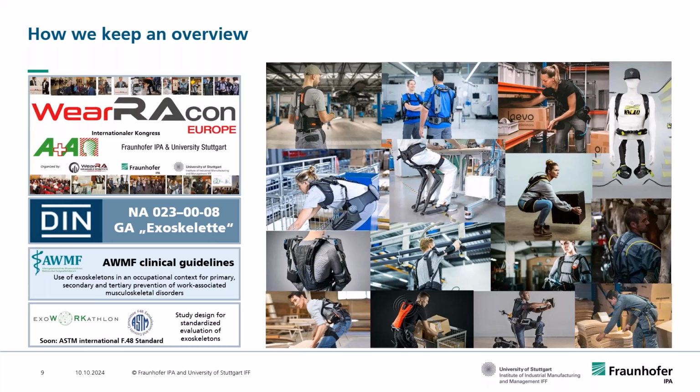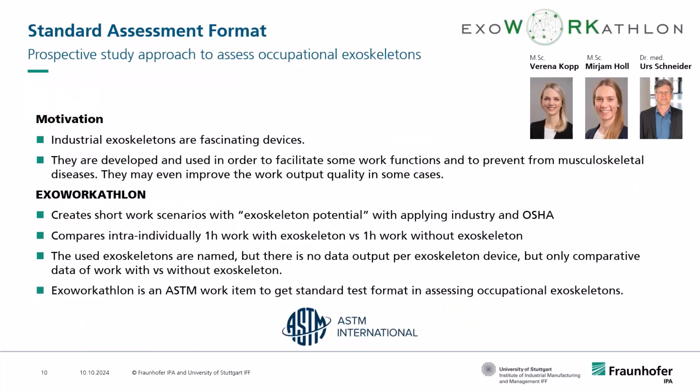And we work in standardization committees such as the German DIN and the International Standardization Committee of ASTM International, which will soon publish a standardized study design for the evaluation of exoskeletons under lab conditions, but with high relevance for industrial use. And this study format is called the Exoworkathlon. And I will tell you a little bit more about this Exoworkathlon, about this study design.